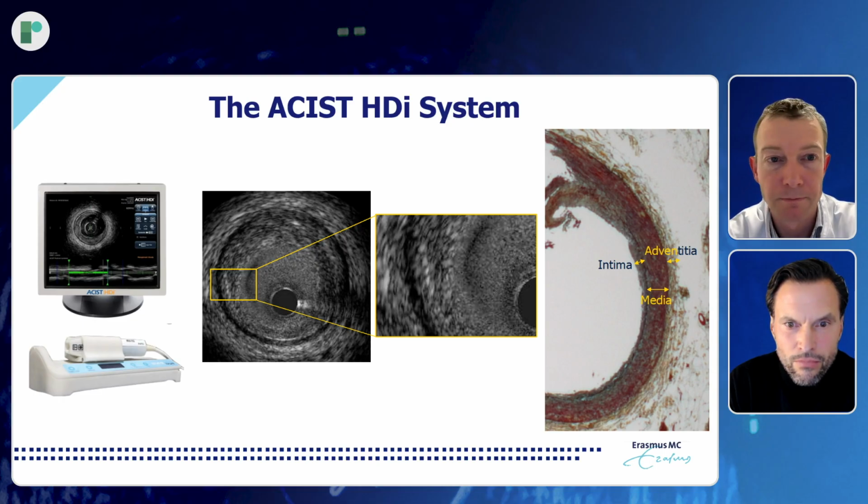Before we go to the next session, Christoph, any thoughts from your side on where you think pros and cons exist between IVUS and OCT? Any particular preference or any specific insights on what you think should be specific cases that may or may not benefit from IVUS? No, I think it's important to have, for your cath lab and your specific procedure, just your default strategy.